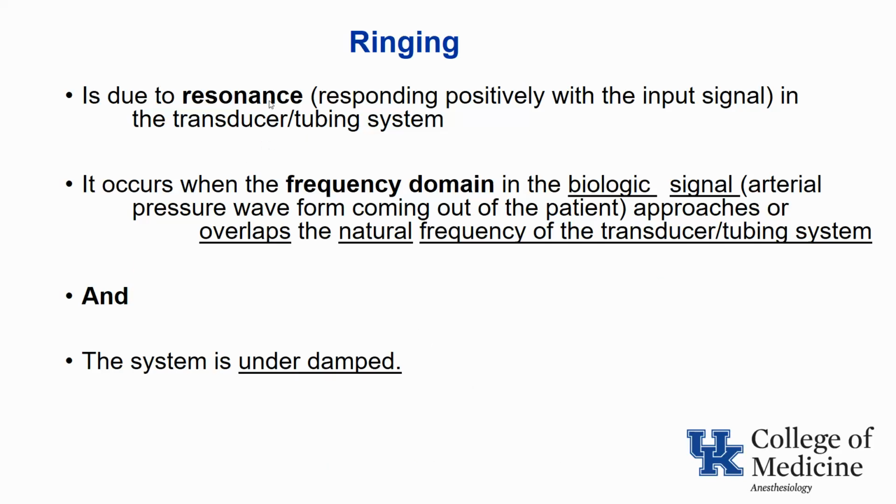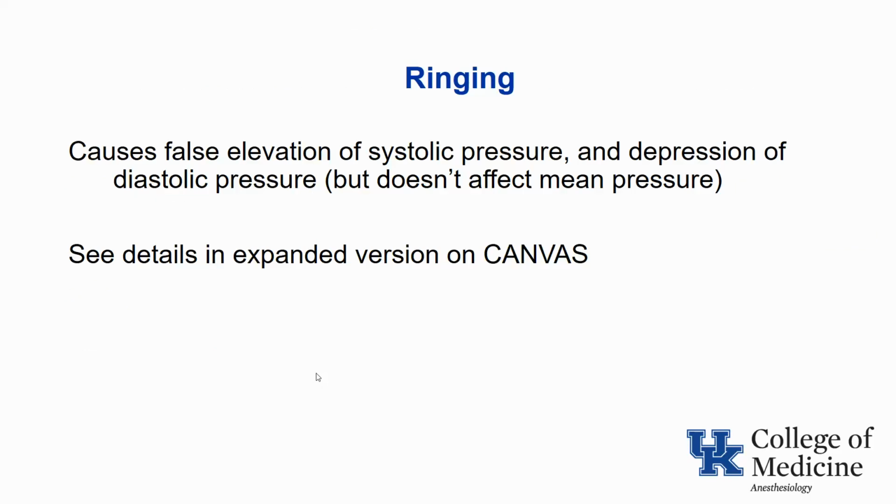Ringing is due to resonance in the transducer system, and it occurs when the frequency domain of the biologic signal coming out of the arterial wave overlaps with the natural frequency of the transducer system, and the system is underdamped.